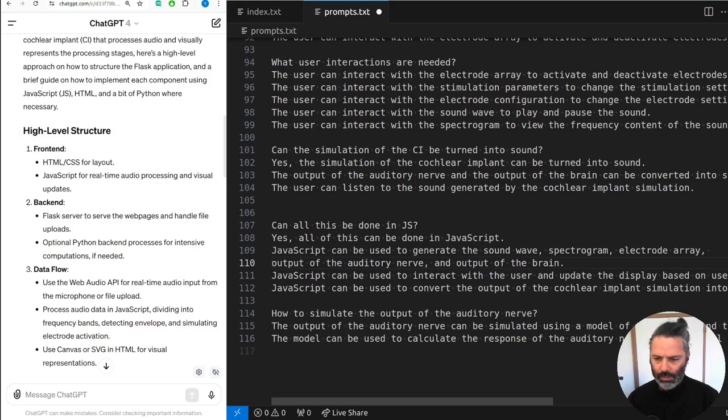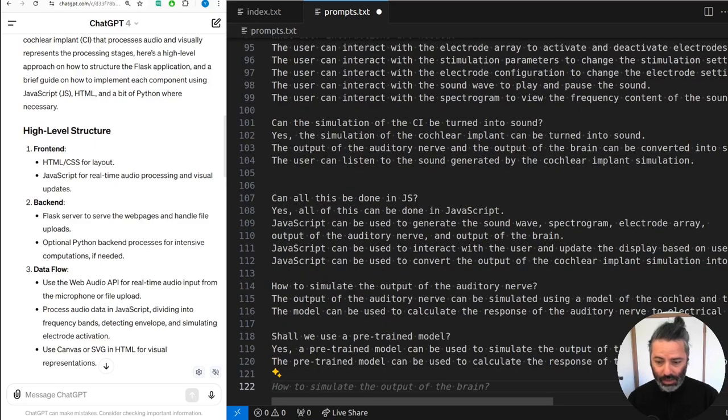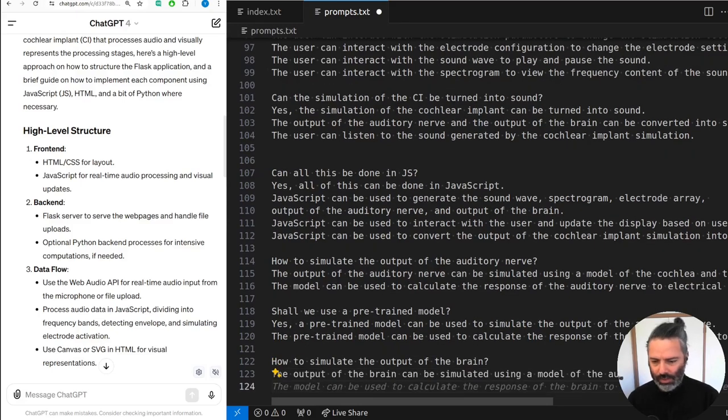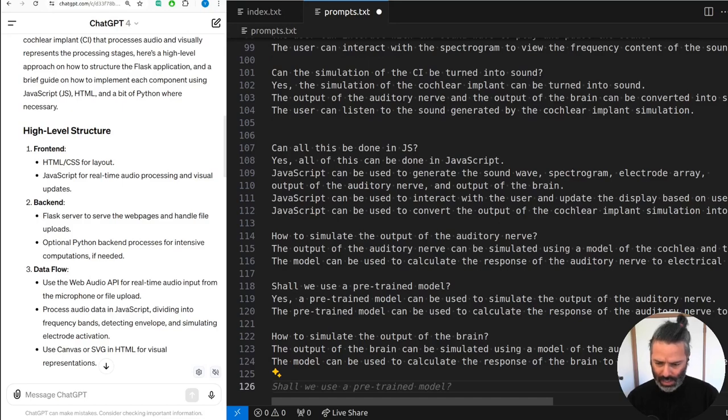So for example, we can use the pre-trained model. Is there a pre-trained model? Auditory nerve model can be used to calculate the response of the auditory nerve. But how to simulate the output of the brain? See, model of the auditory system. Yeah, it all makes sense. It's been trained on all these cochlear implant papers. Shall we use a pre-trained model?